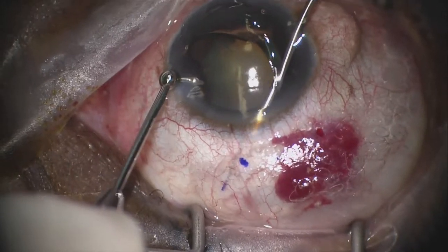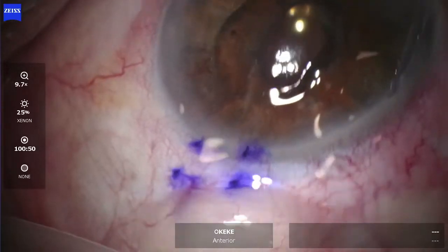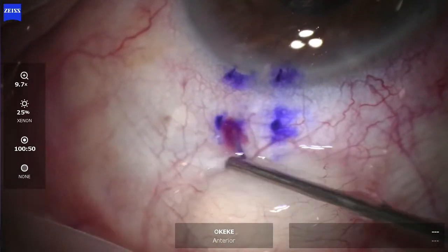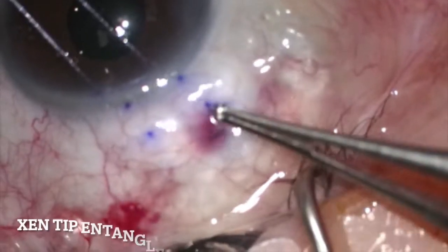Once the Zen Gel Stent is in position, an important point is to assess the mobility of the Zen tip. You want to swipe the tip of the Zen under the conjunctiva side to side like a windshield wiper to see whether it is freely mobile or entangled in tenon's tissue.